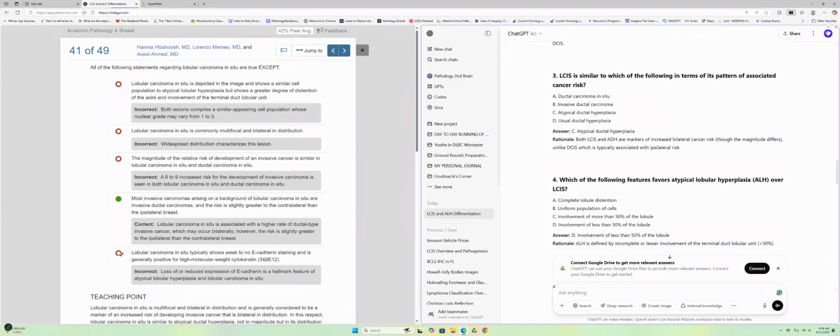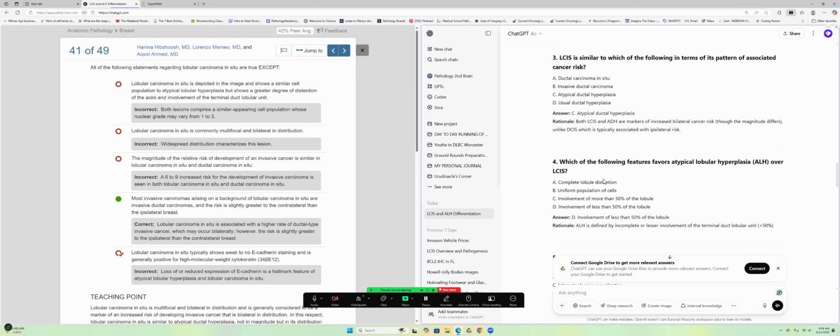Ordinarily, I would have said DCIS. They both have a pattern of bilateral. ADH. But if you look at it in terms of increased risk, in terms of pattern, it's ADH. But as regards the risk, is it DCIS? 8 to 10. Let's say pattern. No, they didn't just use the word risk. Pattern, yeah, but it's still dicey. I agree with you. It's not a clear-cut answer.